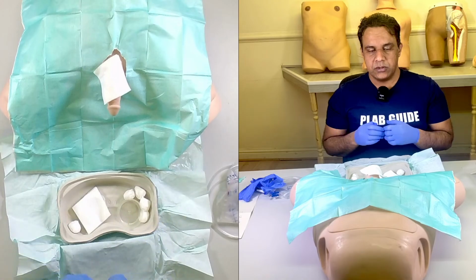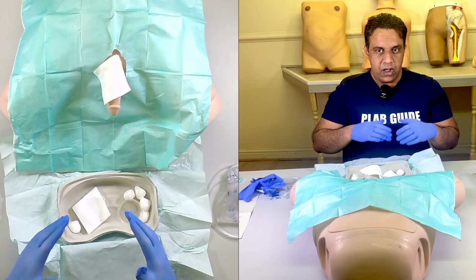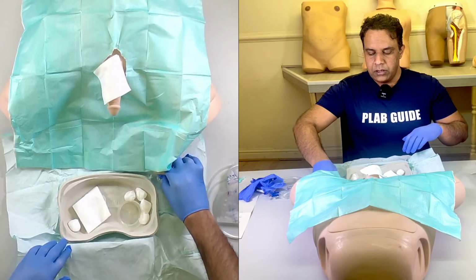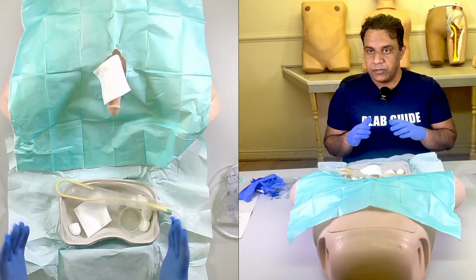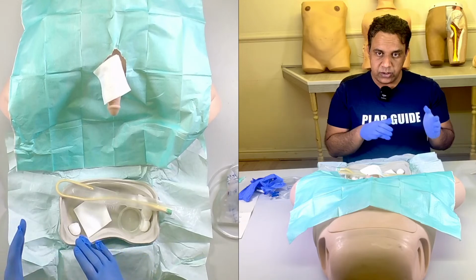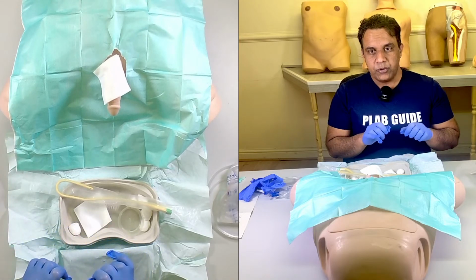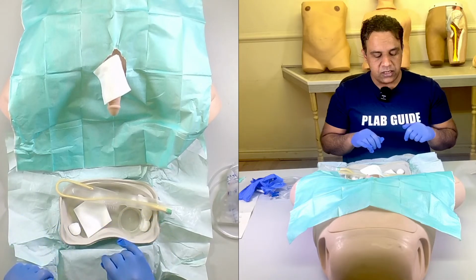Mention this to the examiner or verbalize that ideally I will change the gloves at this point, because the catheter is a prosthetic device that you are going to insert in the patient, and it is important that you change your gloves before you insert any prosthetic device.